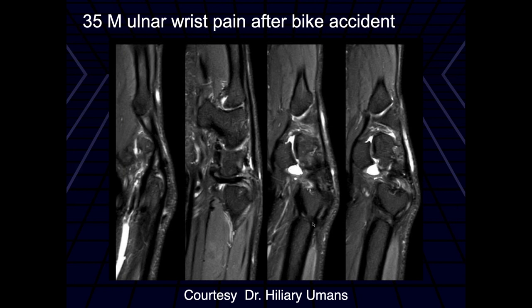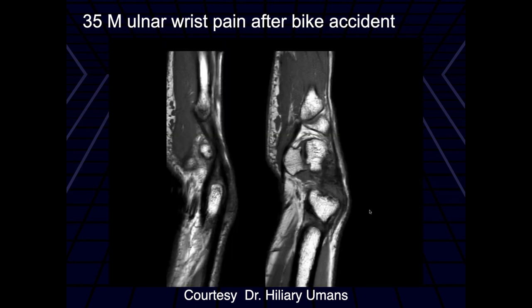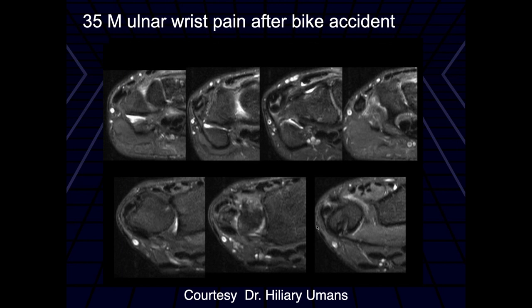So what we have here looks like a fracture, but this is actually a bone tunnel where they had a reconstruction of the distal radial ulnar joint space. This is the bone tunnel, and there's a graft going into the tunnel here, fixed into the tunnel in the ulna.